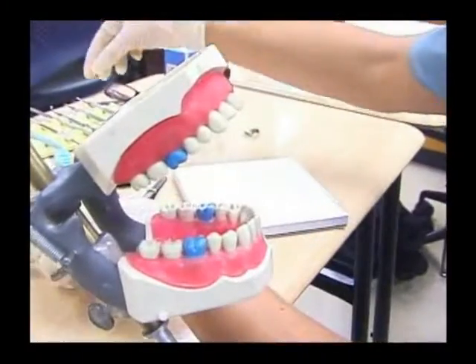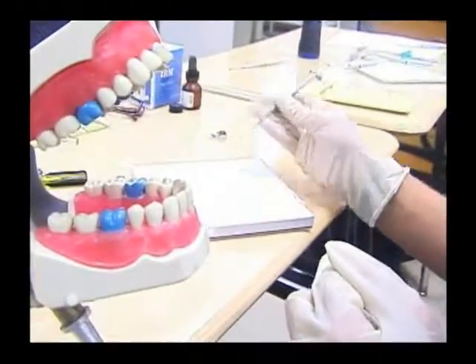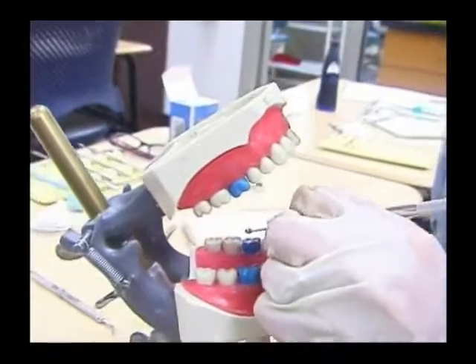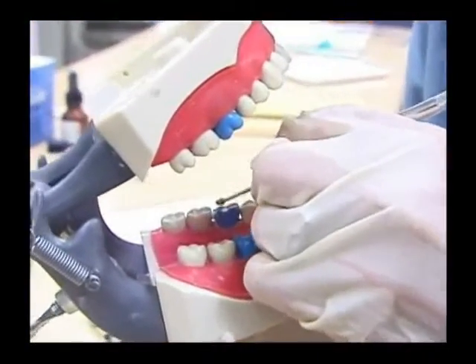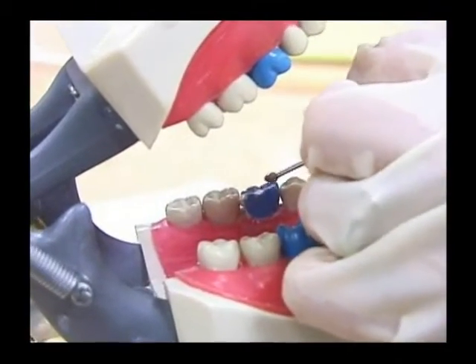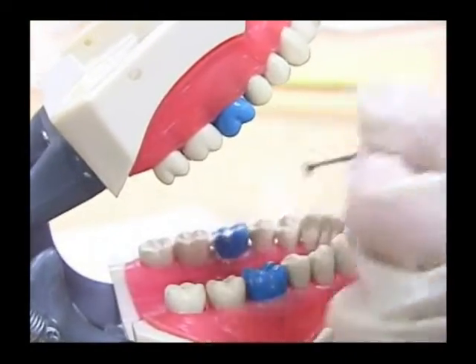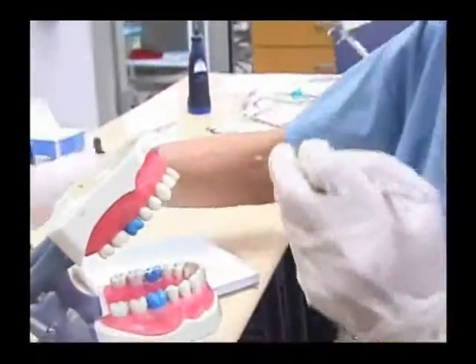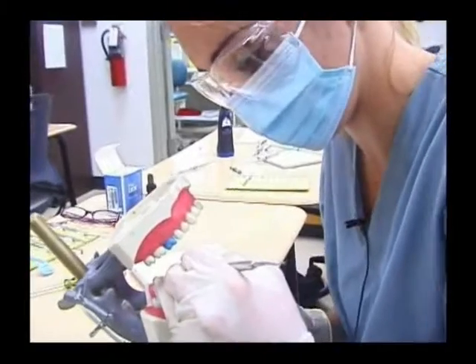If you feel that your margins are becoming unsealed, you can go ahead and dip your burnisher — your ballpoint burnisher — into your powder and burnish it out a little bit so that your margins may become sealed. Then just go back to carving away so you don't have excess material on the occlusal surface.